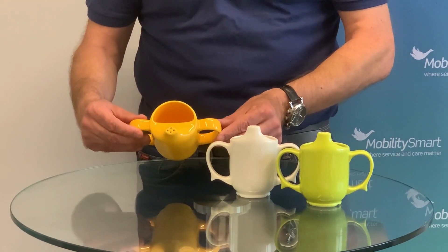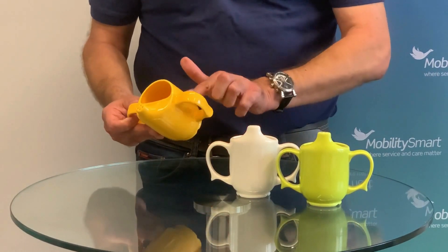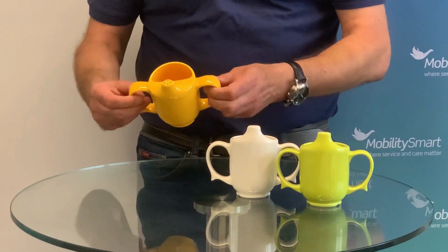The two large handles make it easier for the user to control the flow of liquid. The pierced spout can control the flow of liquid, meaning that there is less risk of spilling or choking.